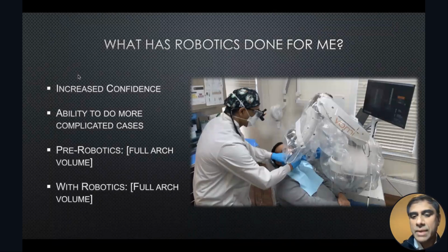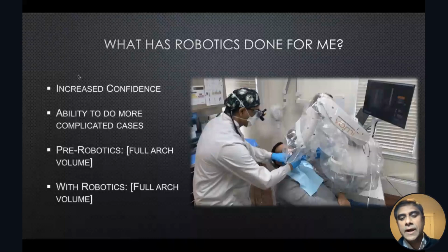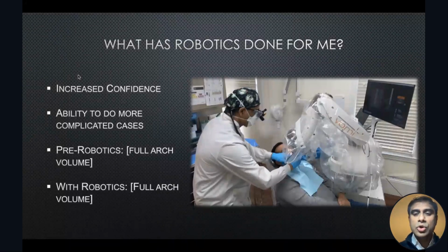You can either have the lab person be with you during the surgical procedures for a quick conversion, or you can even have a PMMA, milled or printed in house or from a third party. Because, as I said, it's a platform. It's not just one surgical kit anymore. You can integrate all your prosthetic and pre-prosthetic planning and get it all prepared beforehand, because there really is not going to be any major diversion.